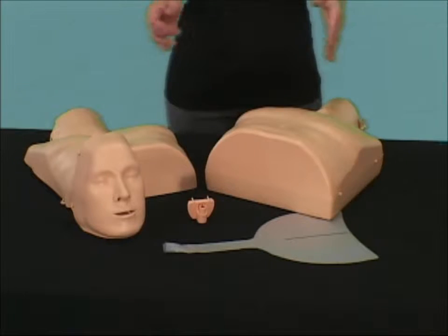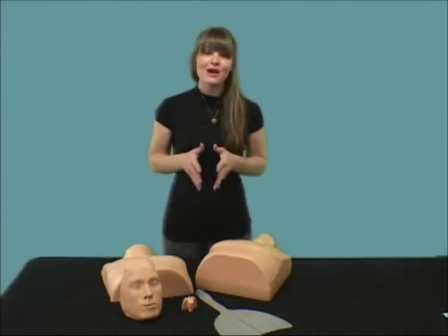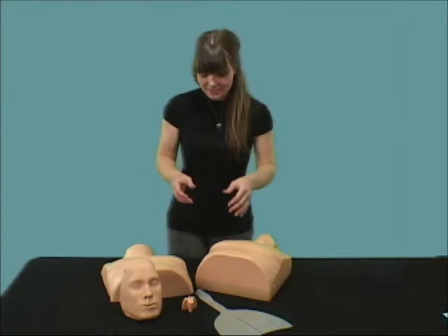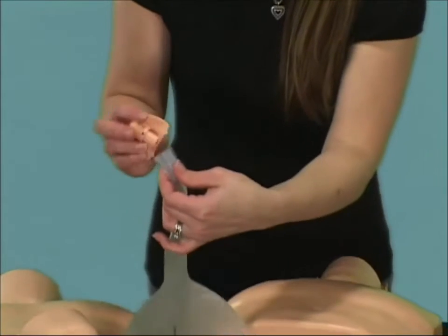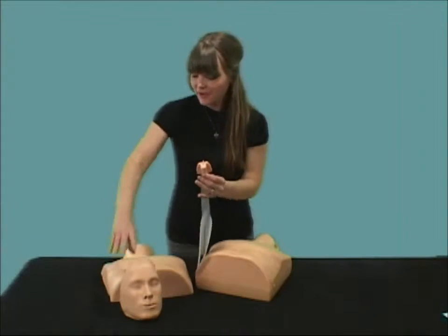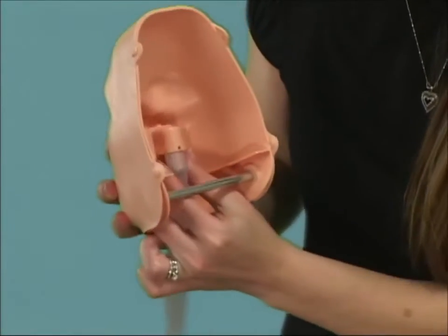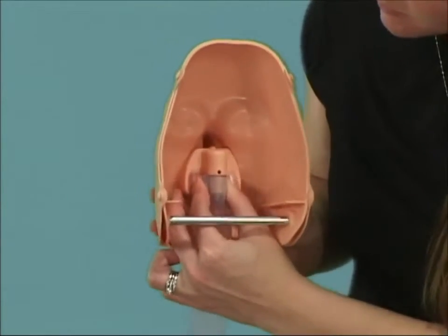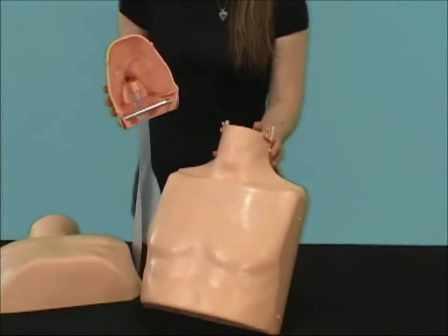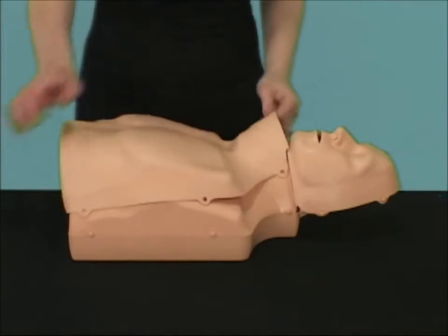Here are all the parts you need to put the mannequin together. Assembly of the mannequin is quite easy. All you need to do is connect the bag to the valve, connect the valve to the head, connect the head to the body and cover with the skin.